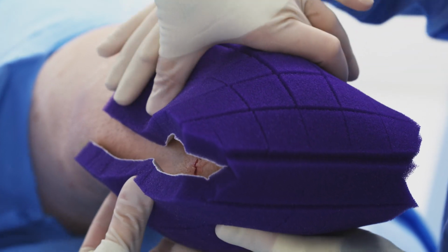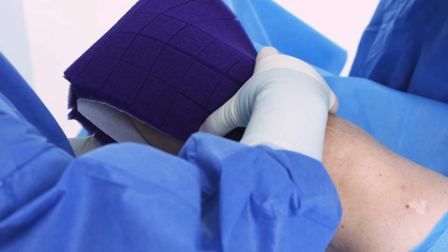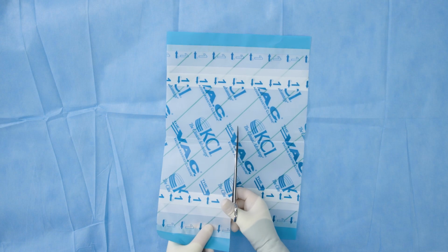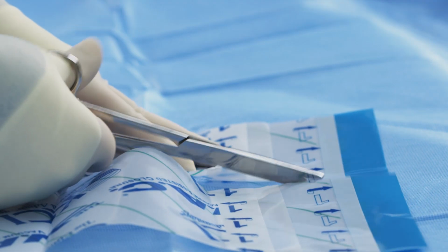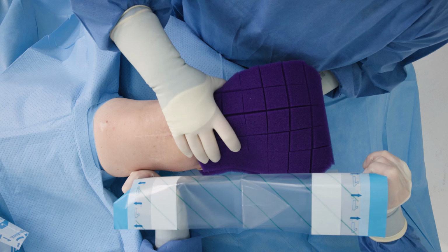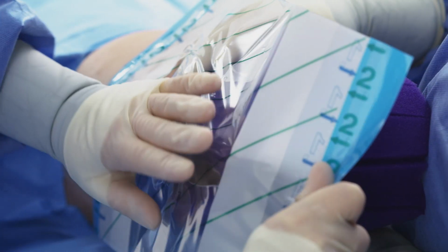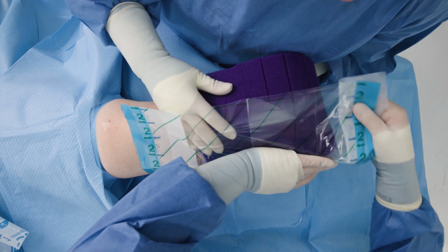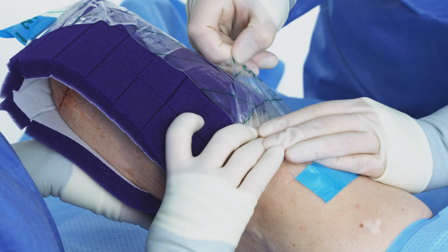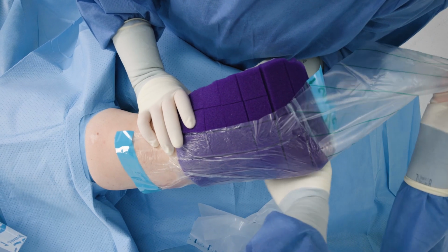Fold the foam over the incision area, folding it around the leg, applying even pressure to adhere the sealing strips. As you cut the drape, remember to allow for 1.2 inches of overlap when using multiple pieces of drape. Place the 3M vac drape on the posterior side of the leg with adhesive side up to facilitate a sandwich technique. If possible, have another clinician hold the foam in place as you apply the drape.